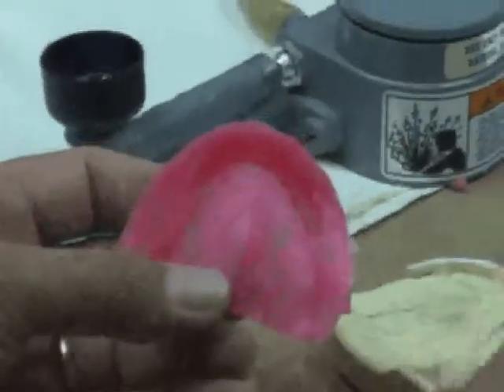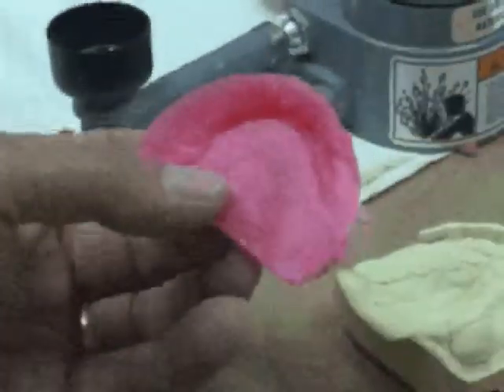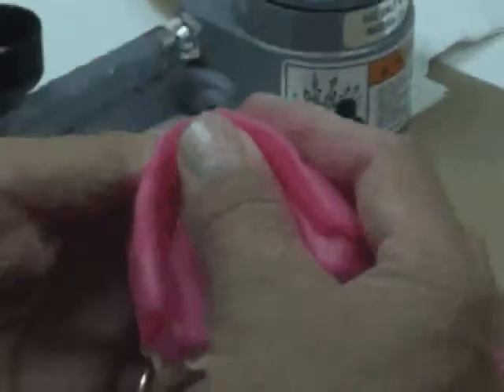right where the line is that we drew on the model, or into the mucobuccal fold. See, we're a little bit short on this right now, so I'm going to put it on the model and then we're going to push it out a little bit around.